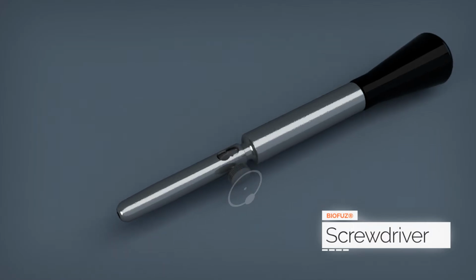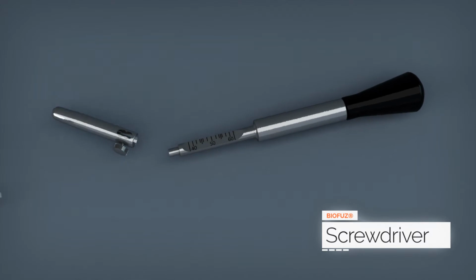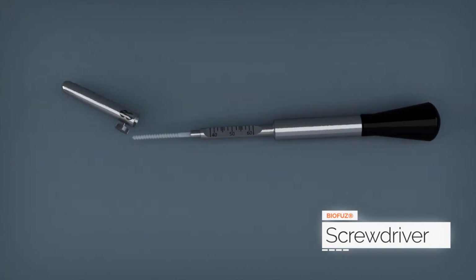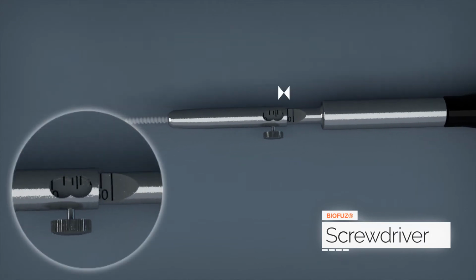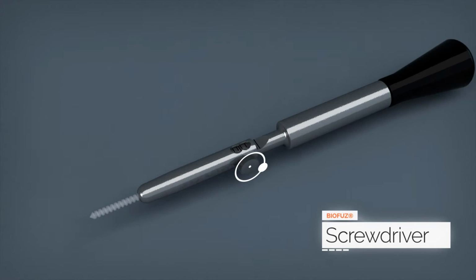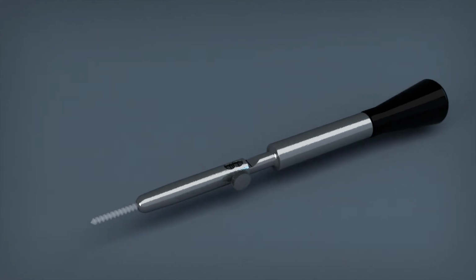Separate the tube from the body of the BioFuse screwdriver by unscrewing the wheel. Connect firmly a screw on the screwdriver and replace the tube. Now report the depth of the hole on the screwdriver by moving the tube. Screw firmly the wheel. Now insert the screw into the drilled hole.